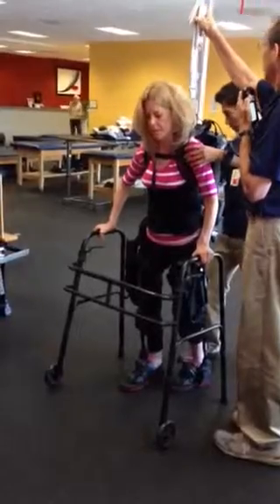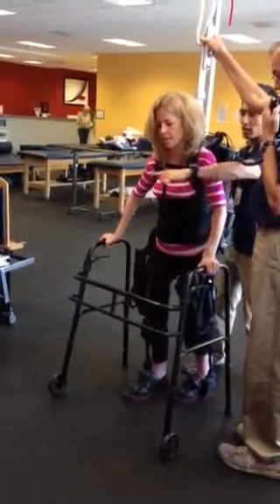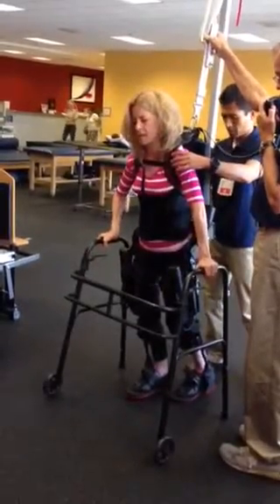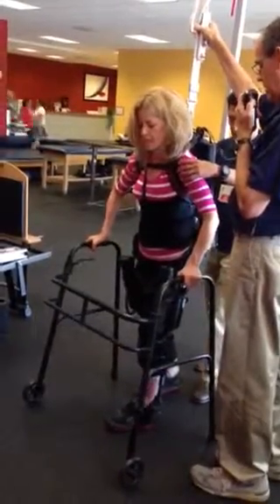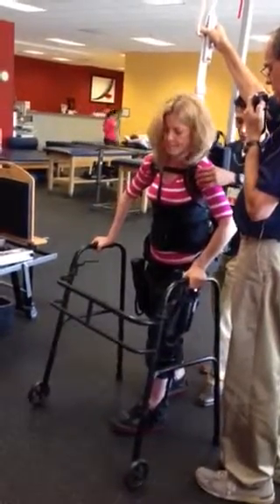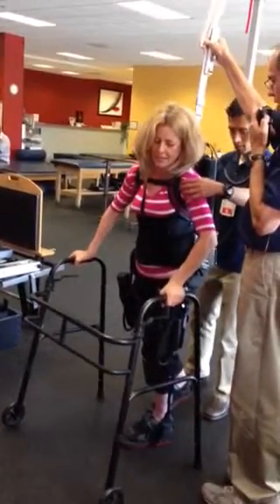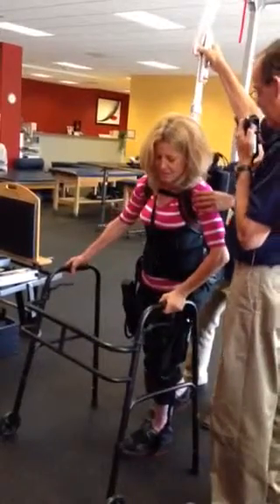Let's go ahead and go with the walker. So now you're leaning this way — I need you to lean to the right. Get over that leg. Perfect. And step. Good. Push that walker forward. Lean left and forward over that left leg. I got you — you got it. Now lean left some more. Use that right hand to push. Perfect. Hold it and step.